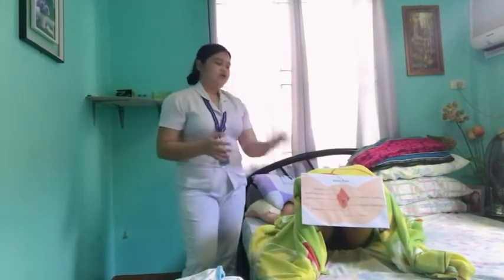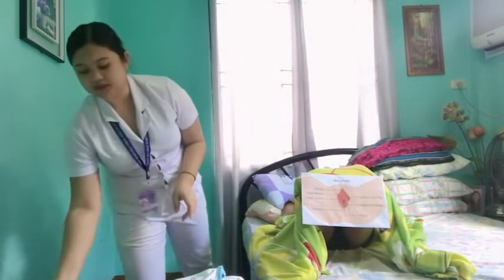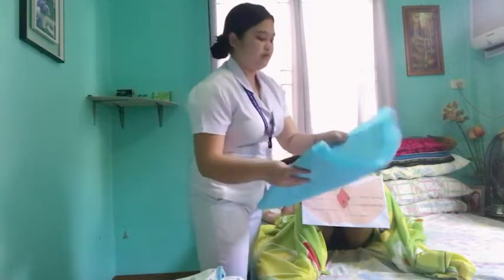Okay, so draping the patient means minimum exposure, the lesser the embarrassment. So, of course, it is to provide warmth also. So, don't forget to place waterproof underpads to prevent the bed becoming soiled.